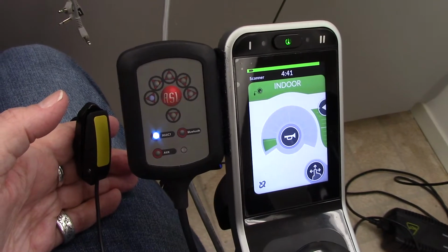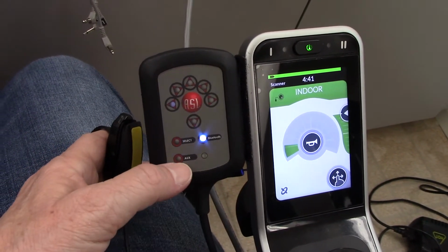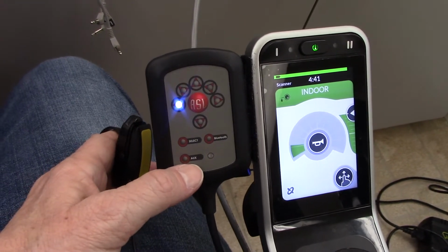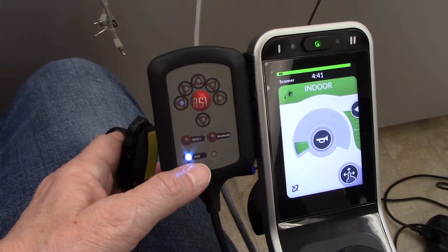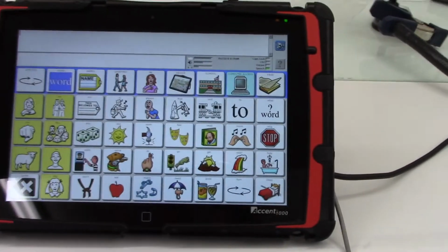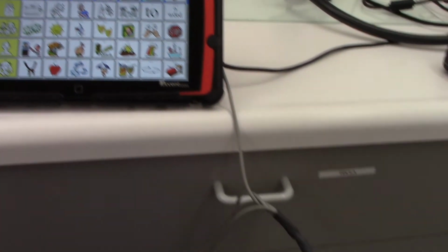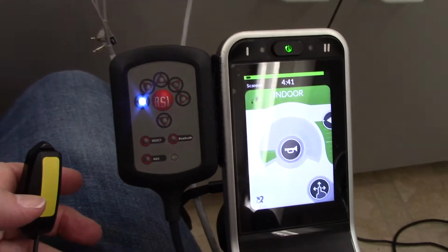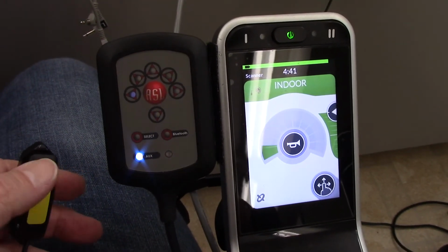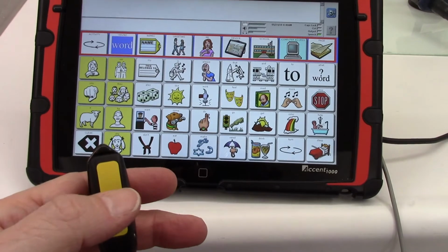Now we want to scan into what we call the auxiliary module, or it's this button, this light right down here, and that, remember, is the 9-pin cable that I showed you that's plugged in, and then I took the forward end of those jacks, the forward one, and it's plugged into a communication device, okay, sitting right here, and it's going to scan when I go in here. So I'm going to go down here, I'm going to wait for it to be at auxiliary. Okay, and you hear it start scanning. So there's my communication device, and here's my switch, right?